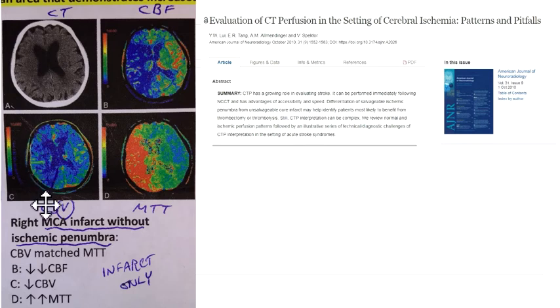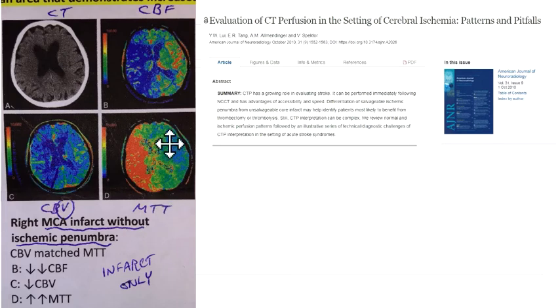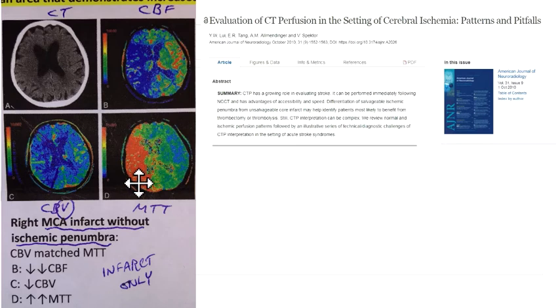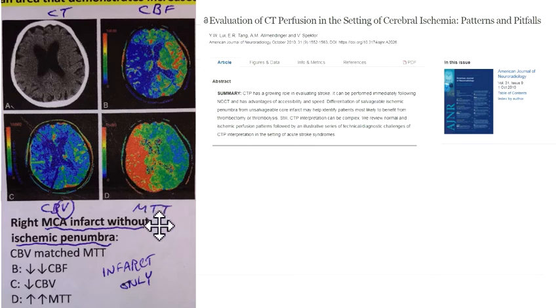Once you find the defect, compare the CBV to the MTT. I would always put the CBV here and the MTT here when reading them, just for consistency — it makes it easier. The CBV defect is matched to the MTT defect, so that's a matched defect, which means it's a completed core infarct with no surrounding potentially reversible ischemia.